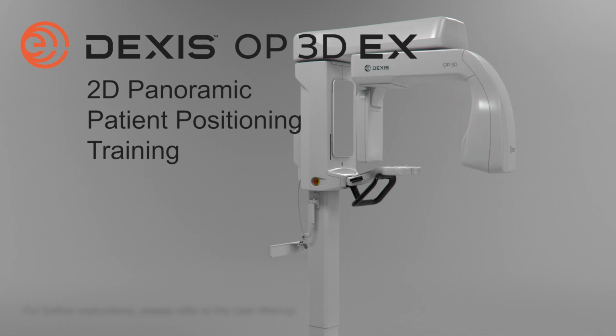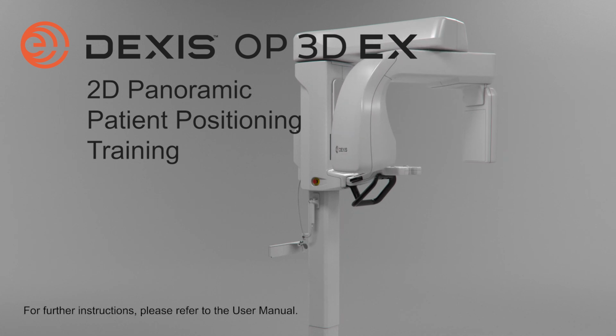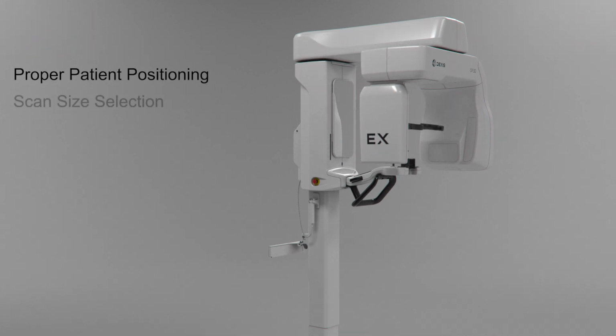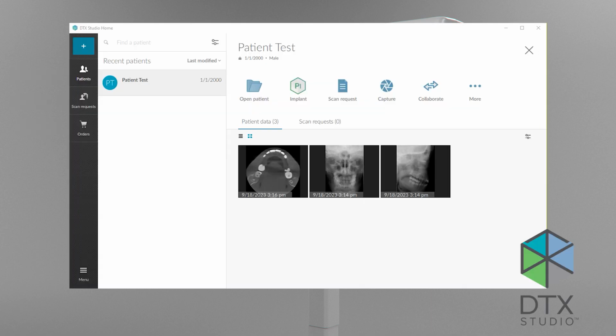Welcome to a DEXIS OP 3D EX training video for acquiring optimum 2D panoramic images. This video covers patient positioning, scan size selections, and acquiring an image. Start by opening your dental imaging software.